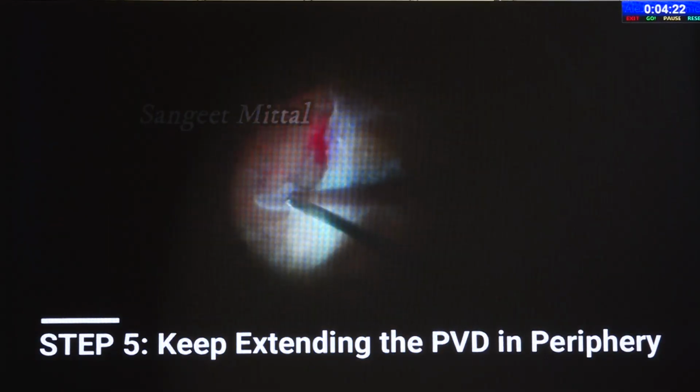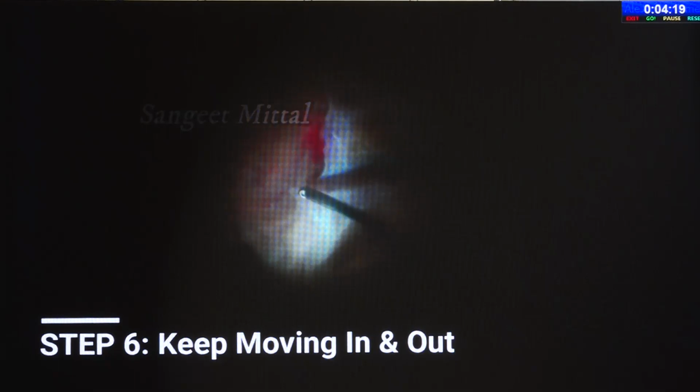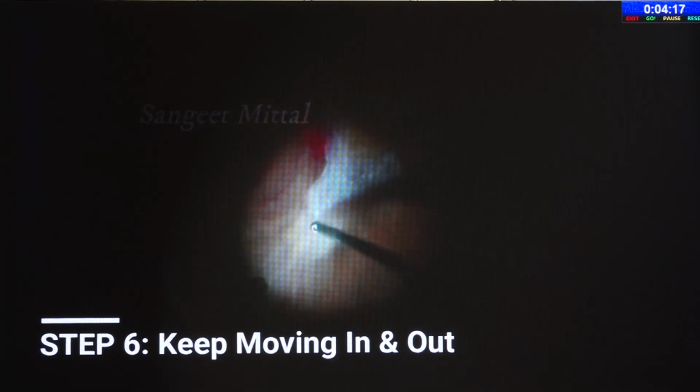So you can do a direct dissection, you can do a rollback dissection depending upon the membrane and the retina below. Such a big membrane, such a tough membrane. With this technique, you can dissect it very easily.